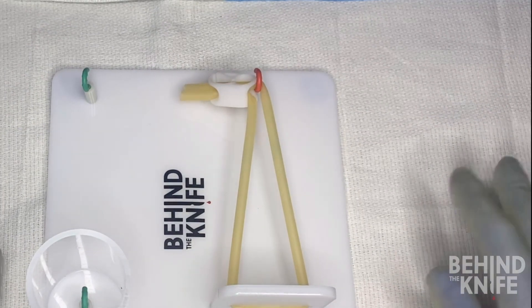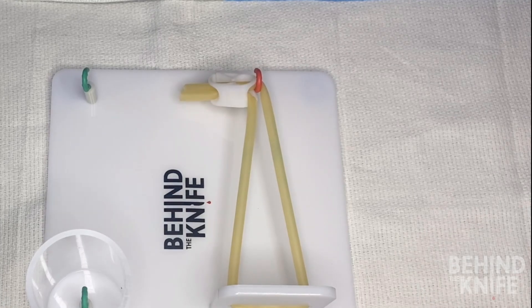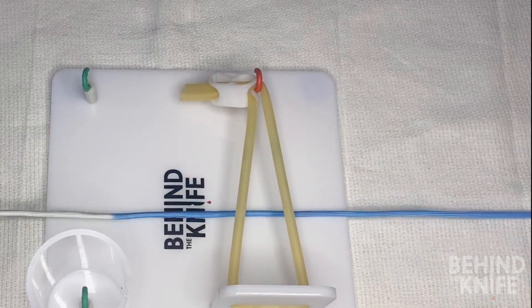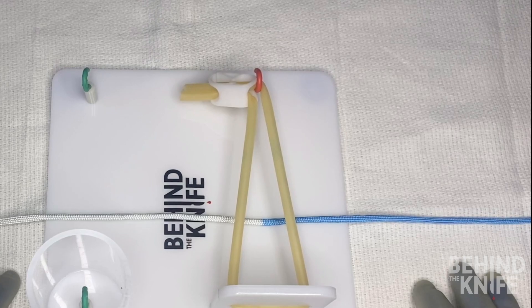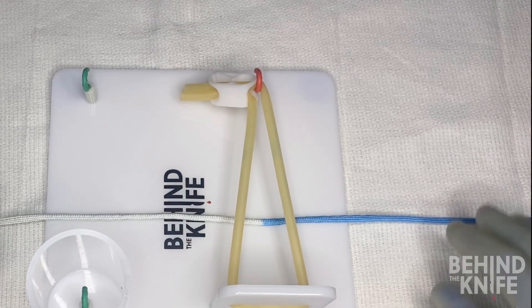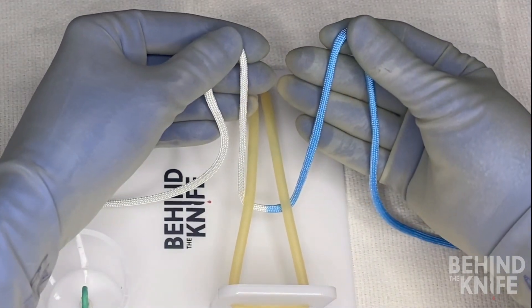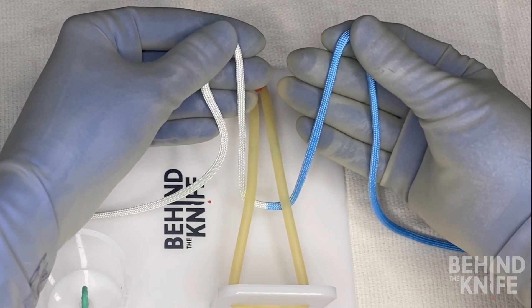To start, we'll put our knot tying board in front of us and thread our practice string behind the side that has the Penrose drain. I'm going to put the blue side of my string on the right and the white side on the left. Since this is a left-handed tie, my left hand is going to be my tying hand and my right hand is going to be my post, which means my left hand is going to be doing most of the work.